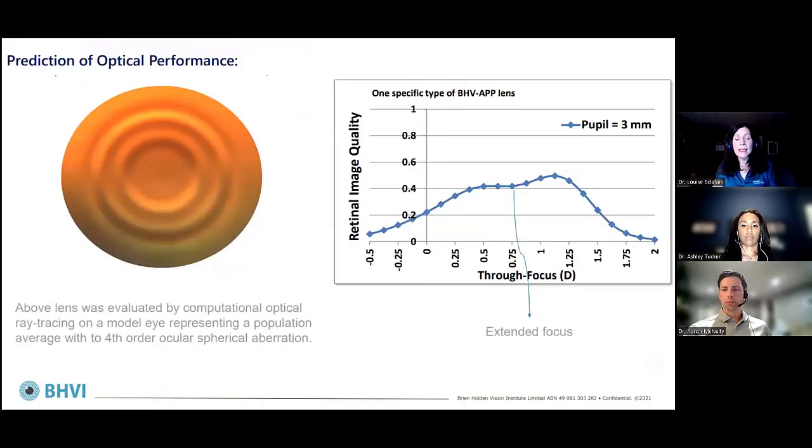The way this lens works, again, is in front of the retina. Anything that you want to be focused, from distance to near, has a very successful retinal image quality. That means anything on the right side of this chart shows very good retinal image quality, because that's most important. It's important to our presbyopes, it's important to our kids. But anything that is focused behind the retina, we want to have really poor retinal image quality. That all has to do with peripheral defocus and not wanting the eye to grow toward the back of the retina, to expand.